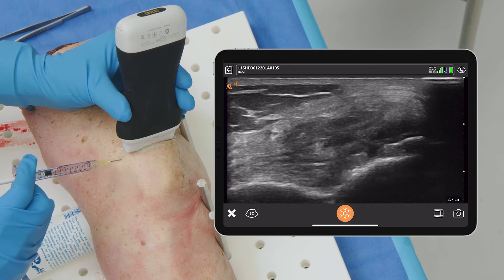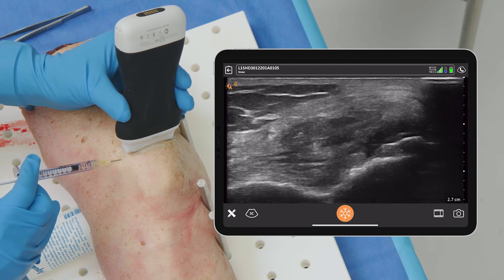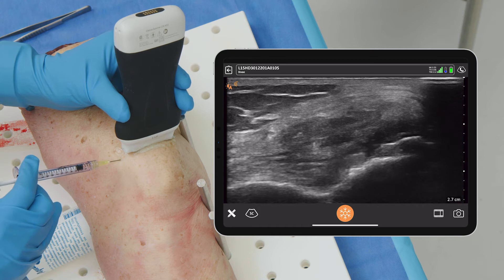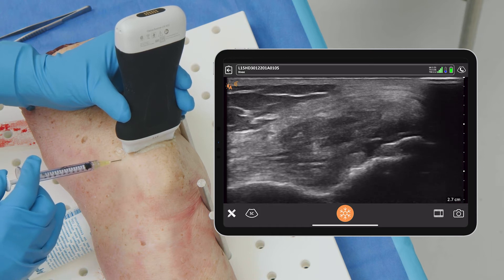I would do an injection and you can see the fluid flowing right now — it's clearly flowing easily. It's not creating a bubble. We know we're in the joint, flowing throughout the joint. If it were creating a bubble, you'd be in the fat or in some kind of soft tissue, but there's no bubble being formed. So we know we're in the right spot.